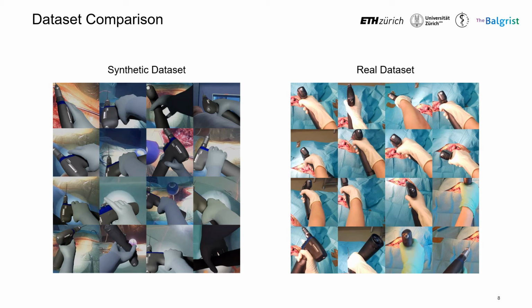For increased diversity, we used 2 pairs of differently colored rubber gloves and let 2 different users operate the drill. The real dataset consists of about 2,300 frames. All samples have a resolution of 256 by 256 pixels.